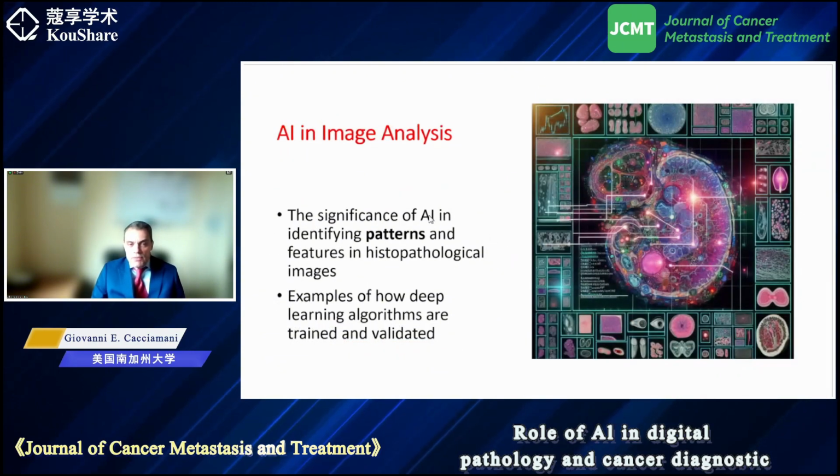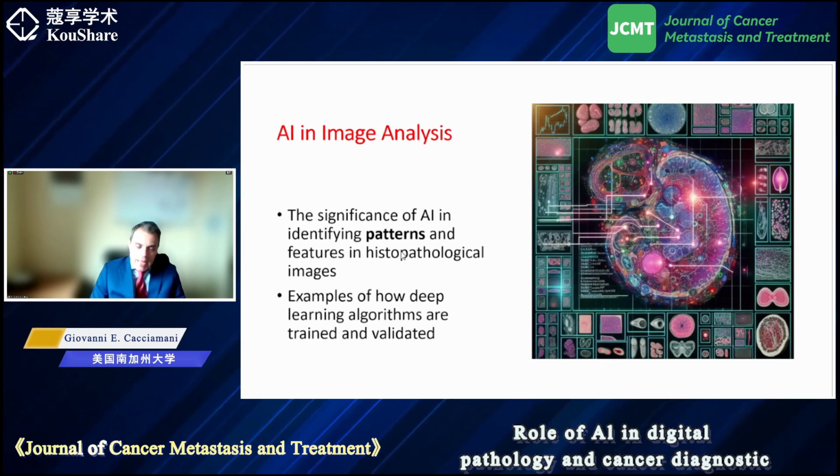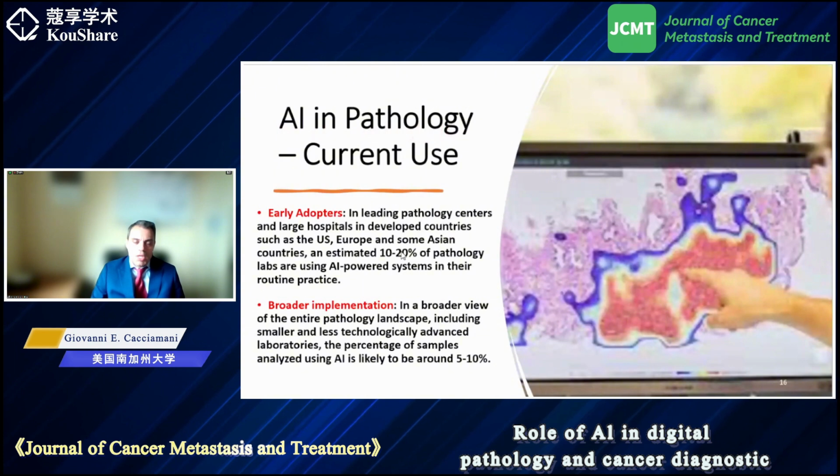And indeed, artificial intelligence can recognize patterns. So what is a pattern? A pattern is something that we first of all need to recognize. So the machine cannot replace the training period for the machine itself that expert doctors have to do in order to recognize our cell's shape, our cell's color, the cytoplasm, the presence of granules, the nuclear shapes, and therefore we can establish an algorithm and then validate it with clinical cases.